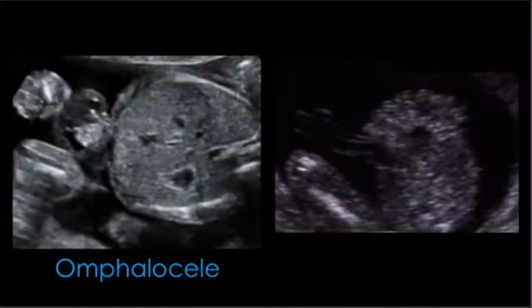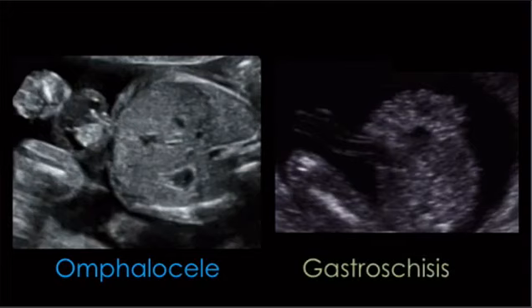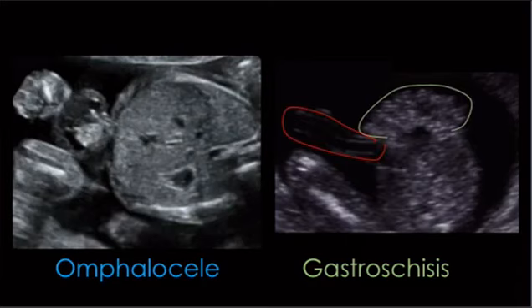So in this situation, we've got our omphalocele showing you that same cut that I had before, and then over here we've got gastroschisis. I'll walk you through. It's this frond-like thing hanging off the side, and you can see that the cord is here, so it's not in the same sac as the cord, and it's clearly not midline. So gastroschisis is this evisceration of the bowel, right? Sometimes stomach and liver.